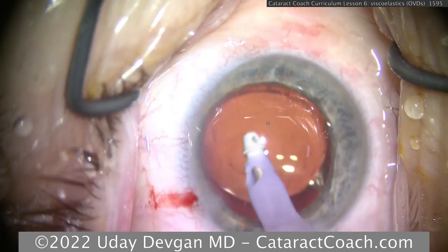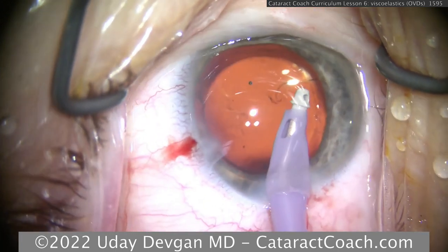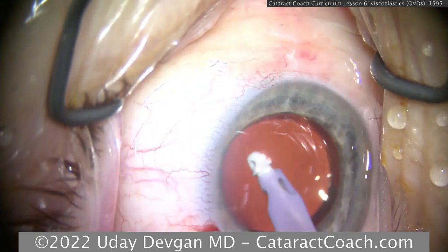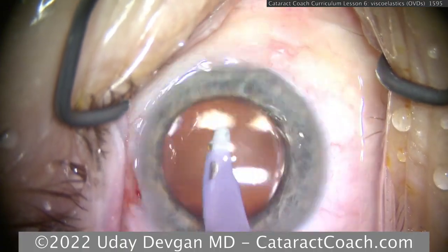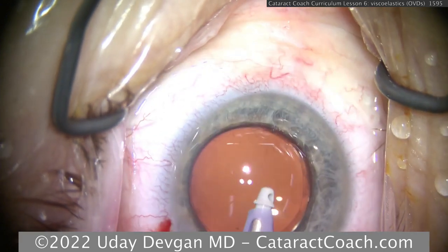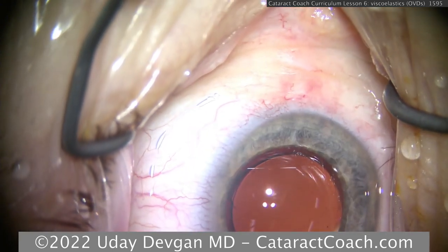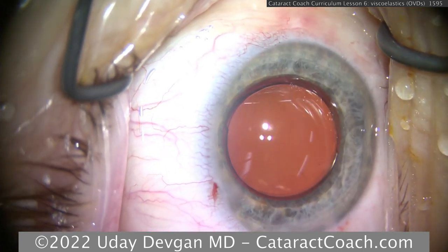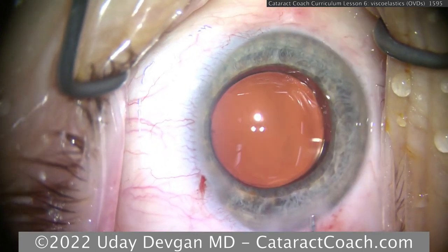In front of the IOL, we have the cohesive plus the viscoelastic that was remaining on the corneal endothelium. We're using a high flow setting here to really get fluid to wash off that dispersive. Here, just cleaning up the underside of that capsular bag and moving in all areas of the anterior chamber to get the viscoelastic out. So interesting case of using two different viscoelastics to do the soft shell technique. Not something I normally do, but certainly something that we can learn from.